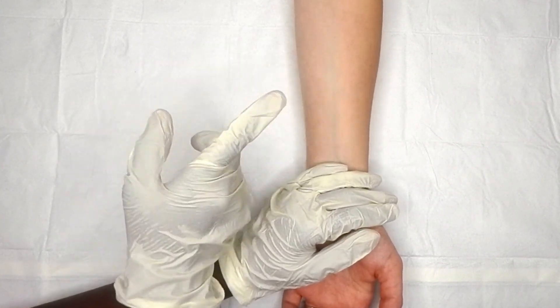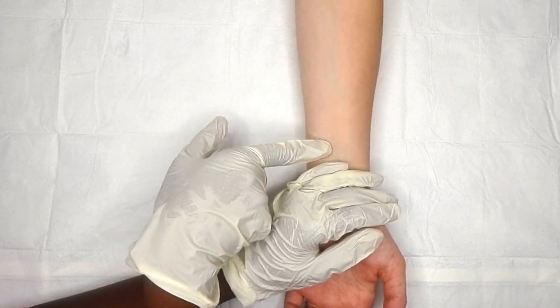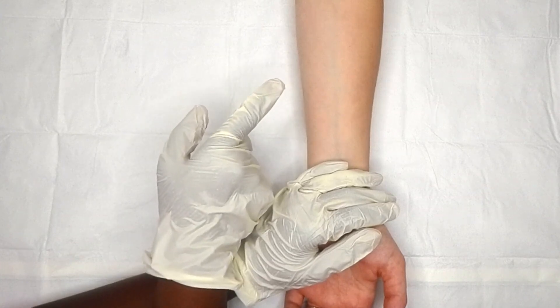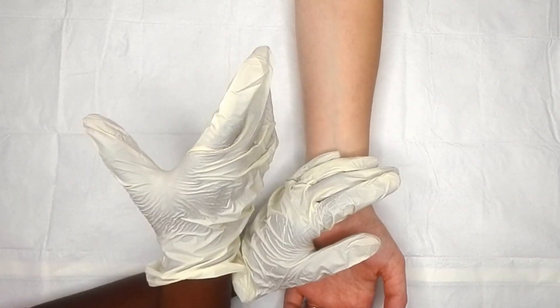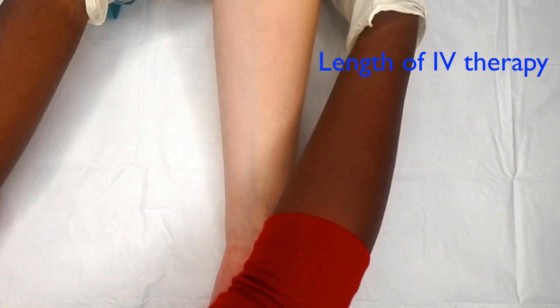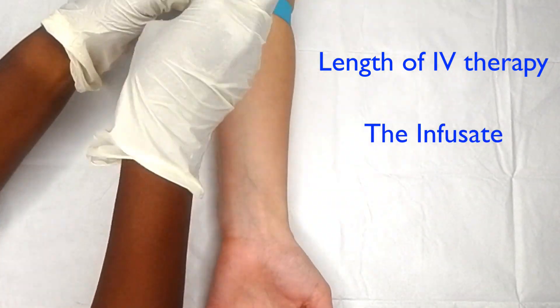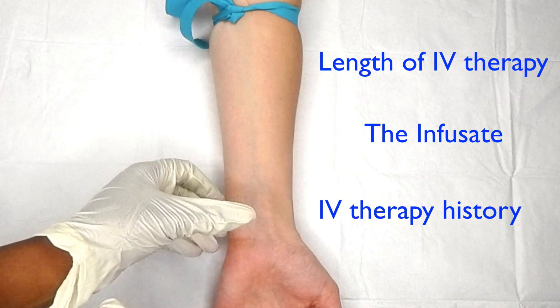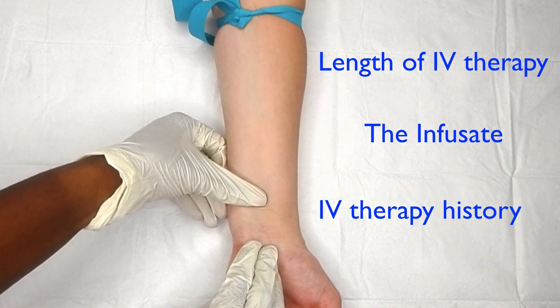Today we're going to go over an IV insertion in the median antebrachial vein. When I'm asked to place an IV, my goal isn't simply to just put the IV in the first most obvious spot. I'm thinking about several things: one, how long will they need this IV; two, what the patient will be receiving through that IV; and three, the overall health and IV history of the patient.